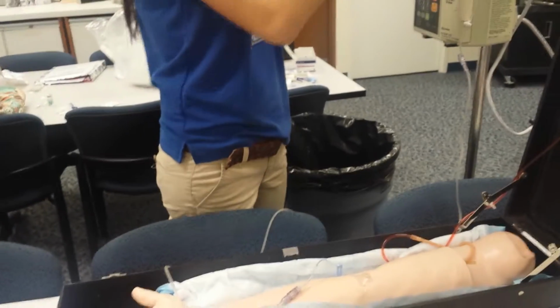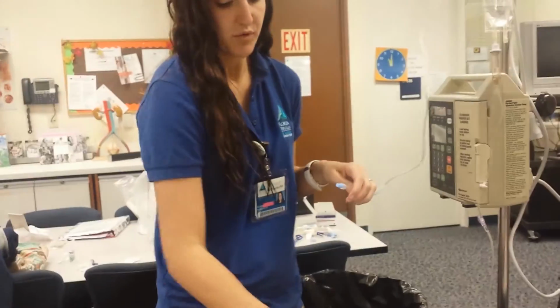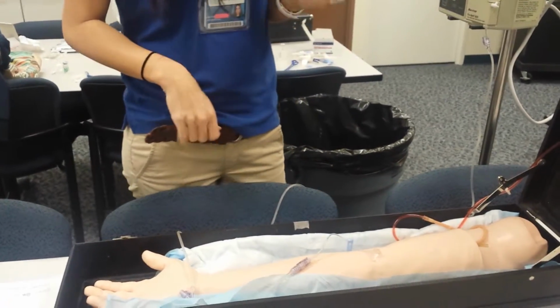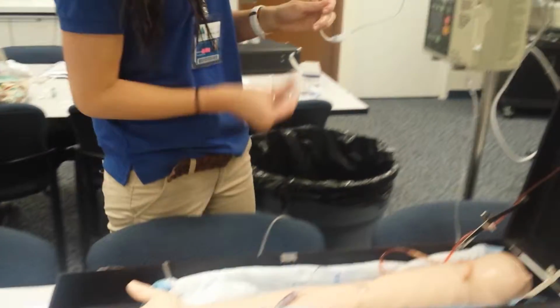We're going to assess where we're going to be using the site. So this already has an IV running. It's flowing, so we know it's patent. But we're going to check for any redness, swelling, pain, or irritation to the site. So he's good, so we're going to go ahead and use this site.